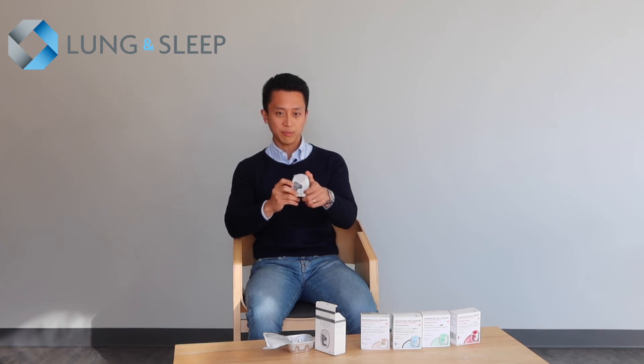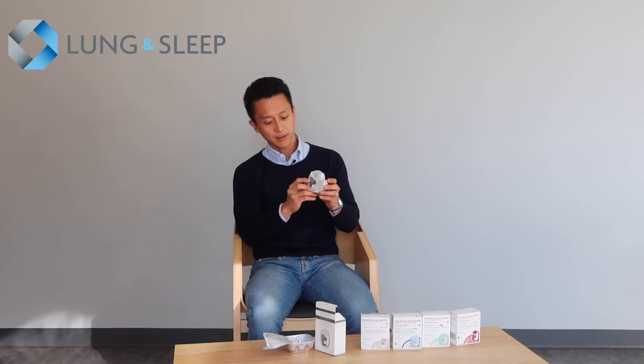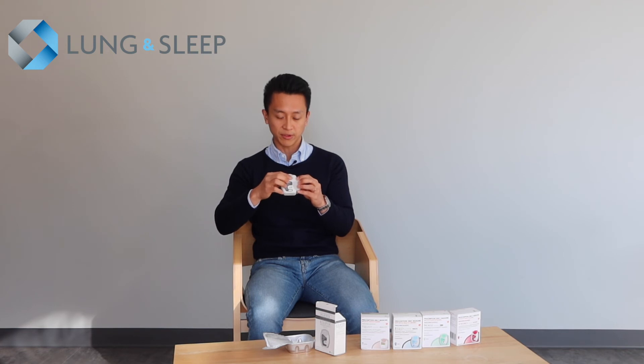Now I'll demonstrate how to use the device. You flip the lid open — you hear a click and the dose goes down by one. There is a vent at the front of the device at the top; that should be pointing upwards. Don't occlude the vent with your fingers — hold it on its side so the vent is open to the air.